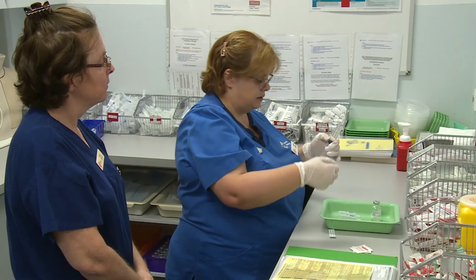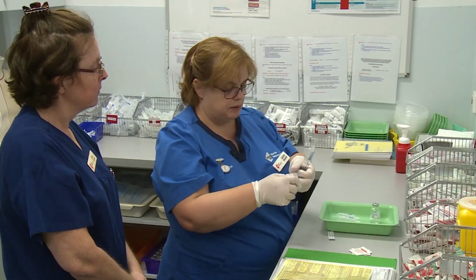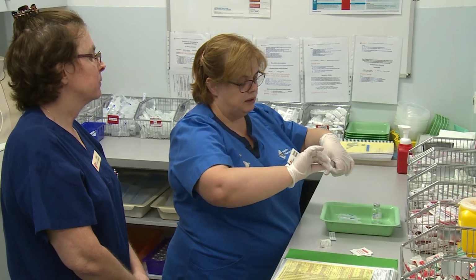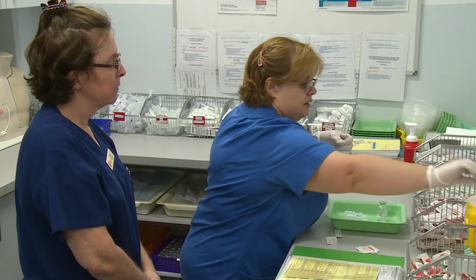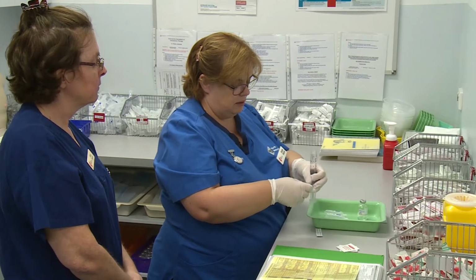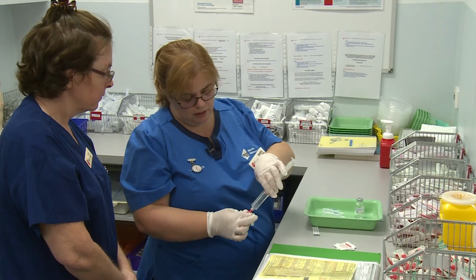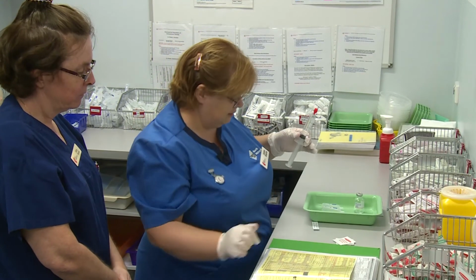All right, so I'm now going to open my bung, have that ready, get rid of my vial access cannula. All the time you can see that I'm not actually touching the top. I'm going to hold this in place, peel this back and hold it back, and then I can put that on without touching. It's a handy little trick I've learned.